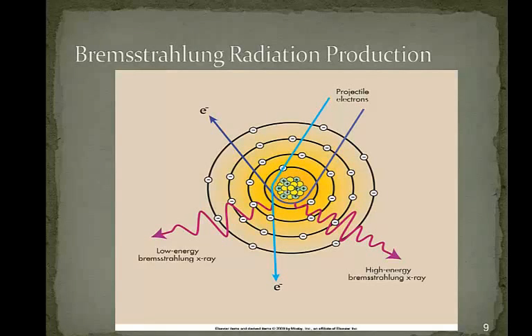When you are looking at the different colors, there is a darker blue and a lighter blue. It's pretty much showing you that the closer it is to the nucleus, the bigger curve it's going to have, so the bigger the loss of energy. For example, the darker blue has a pretty sharp turn, so that means it's closer to the nucleus, and you look at the nucleus charge, it's a bunch of pluses, the electrons are always negative.